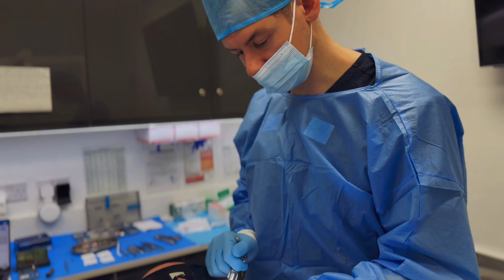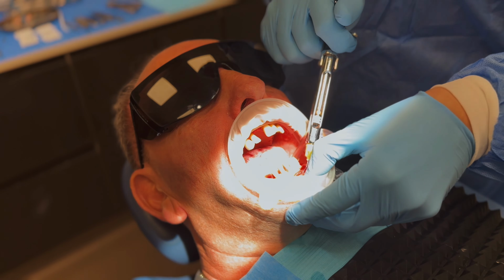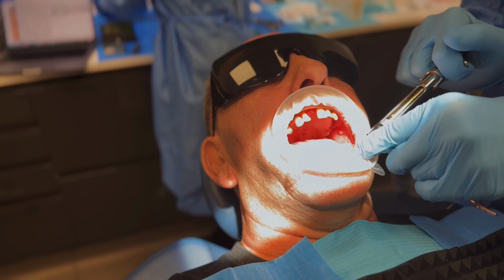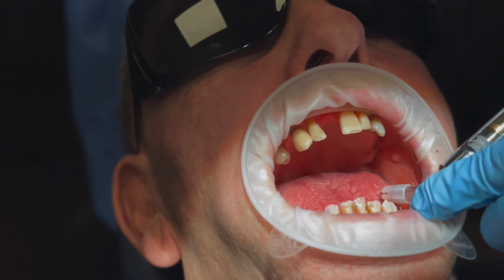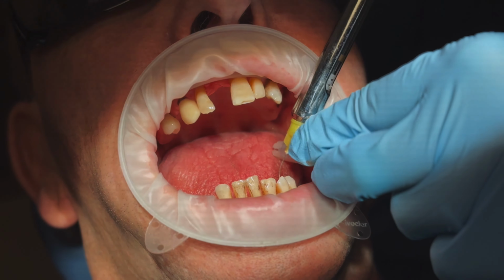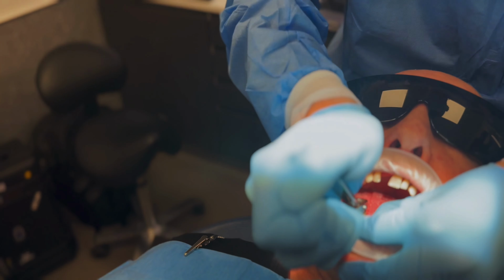So we're just slowly administering an anesthetic, very slowly, so John doesn't feel anything. All good, John? Mm-hmm. To numb up the lingual aspect, we start from the buccal and slowly make our way in between the teeth to numb up the inside, and that's how you can numb it up in a painless way. You feel a little bit of pressure, okay? Mm-hmm.